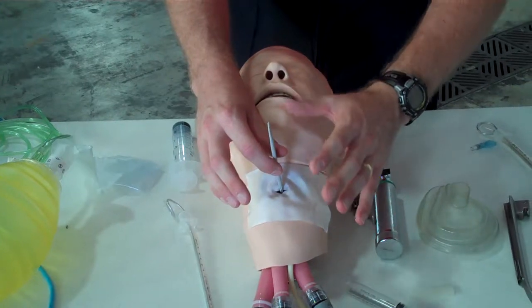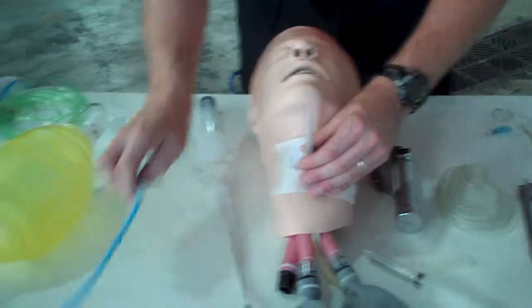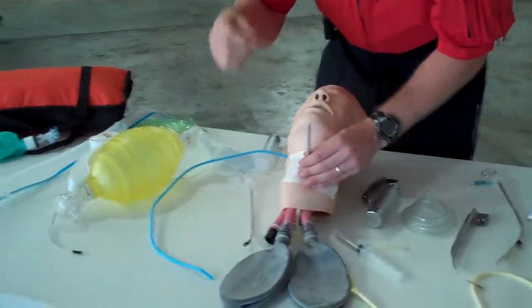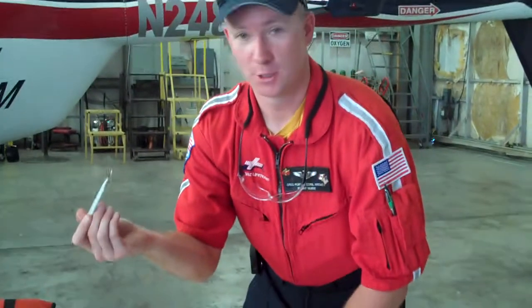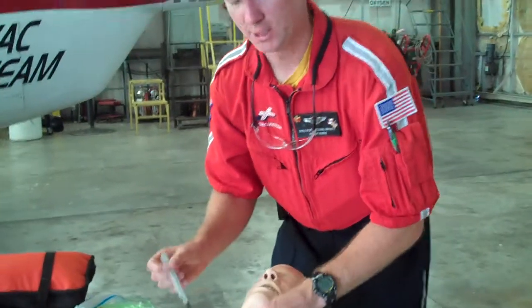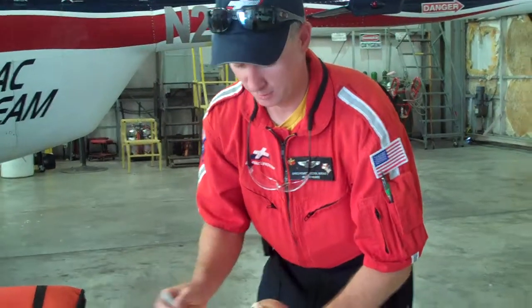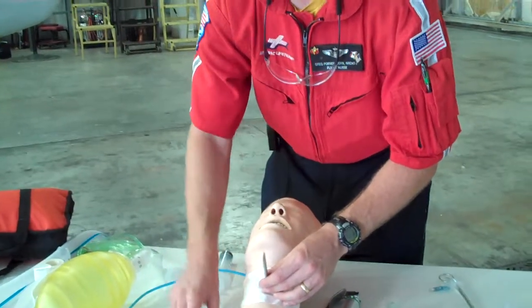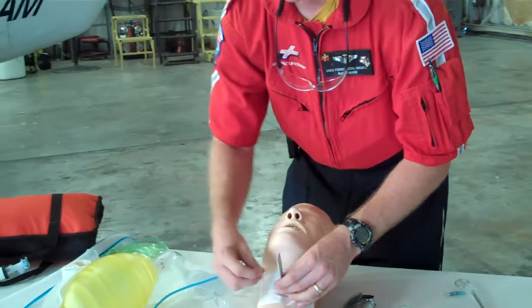I recommend never removing the scalpel until you've got either a bougie, which is a plastic introducer, or some type of a hemostat to keep your landmark. Because once you pull this out, you've got a very sharp object floating around the back of an ambulance or in an ER, which can be dangerous, and you've lost your landmark. These tend to close up, there's a lot of fluid, and you'll lose your landmark. So I always recommend leaving the scalpel in place until I have sterile hemostats in position.